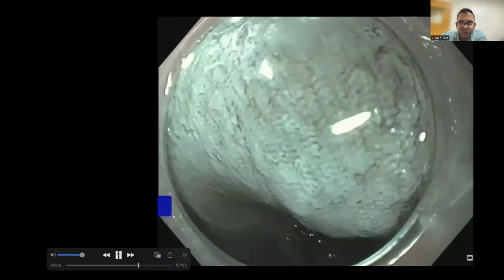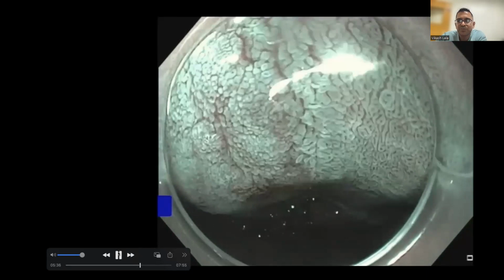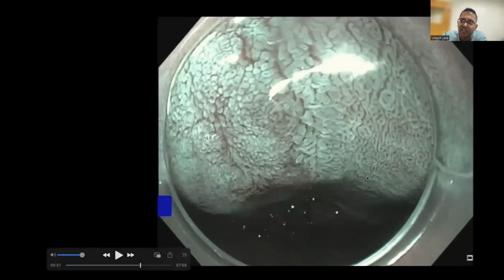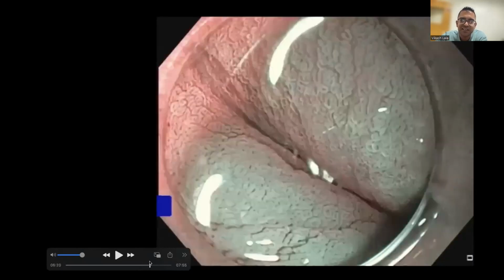And I want to just show you how this makes the demarcated area jump out a lot more. So now look at that. Now you beautifully see the area of demarcation. You can see your classic normal mucosal and vascular pattern. And there you see your demarcated area with the crowding of the glands. So I thought that this was an area of high-grade dysplasia. And again, this is very important to include in your resection, not just take the malignant areas.